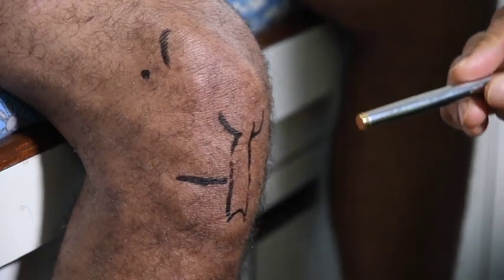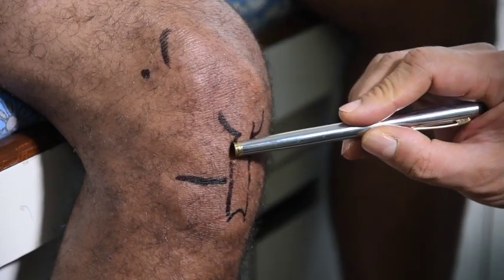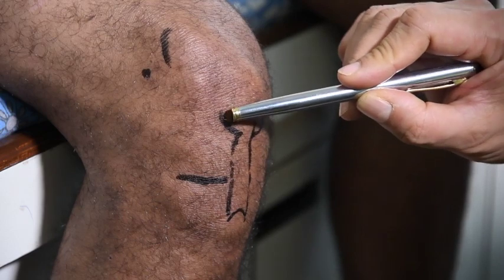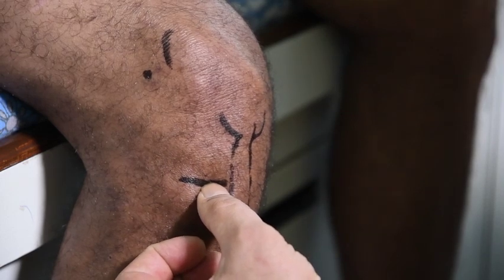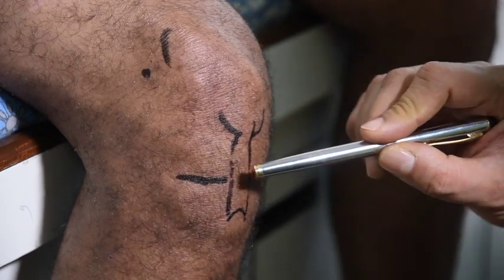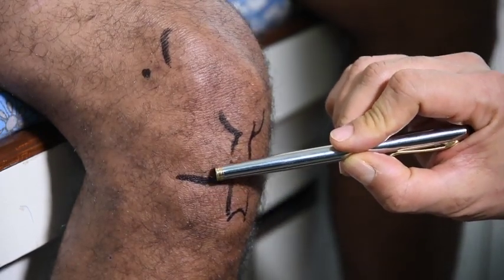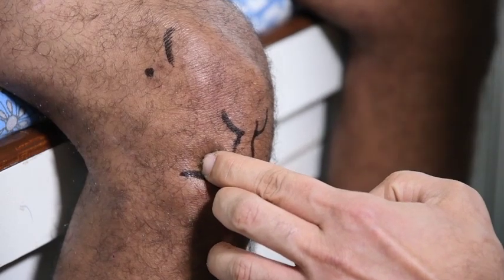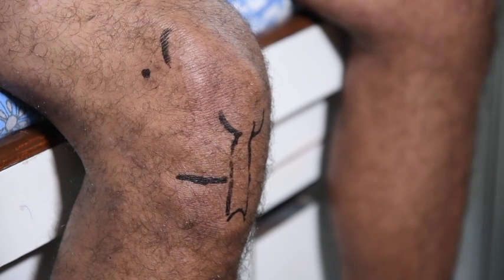I am going to show you a second technique. Here the patient is sitting comfortably — this is a very comfortable technique for the patient. You need to mark the patella tendon. This is the lateral border of the patella tendon, this is the tibial tuberosity, this is the medial border of the patella tendon, and this is the lower border of the patella. Palpate the tibial plateau and mark it — the joint space is going to be here. The landmark is simple: go just lateral to the lateral border of the patellar tendon and one centimeter above the tibial plateau. If you palpate at that point, you will feel that you are entering the joint.